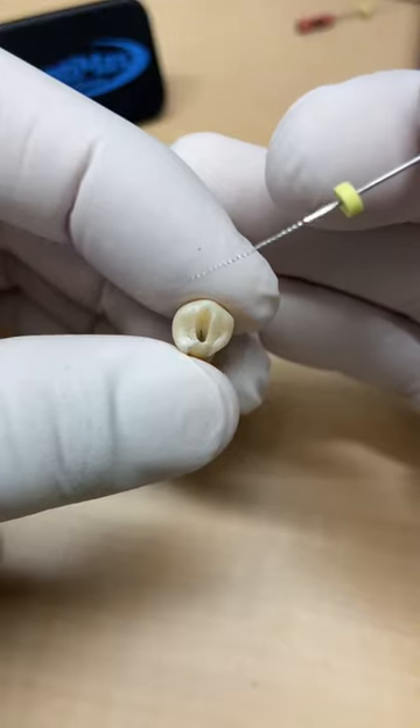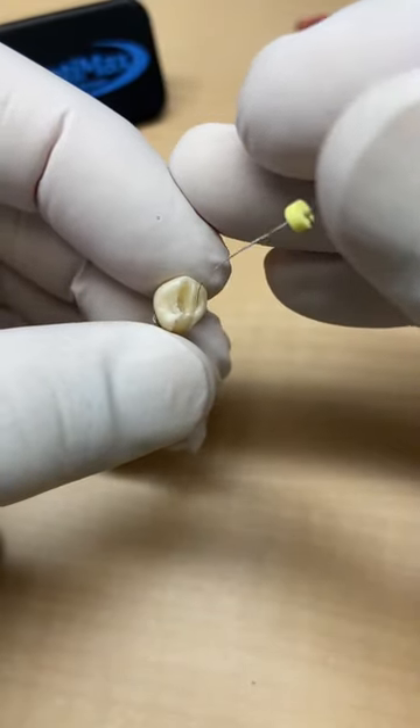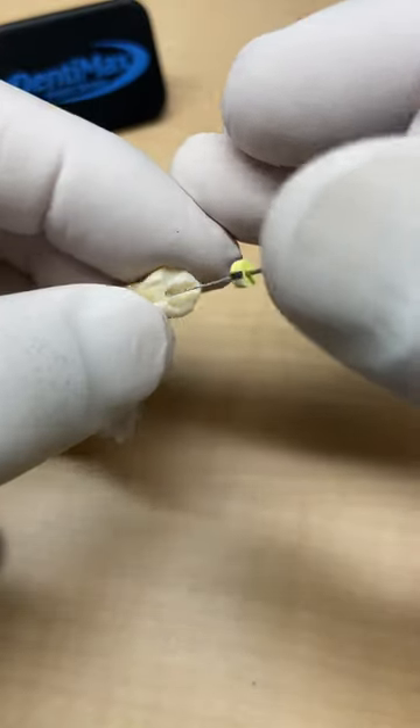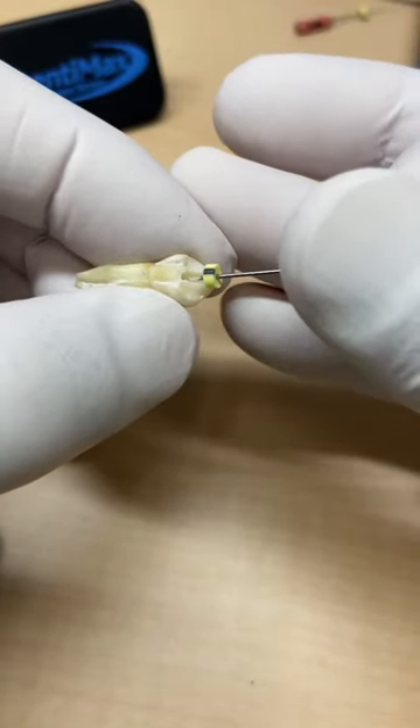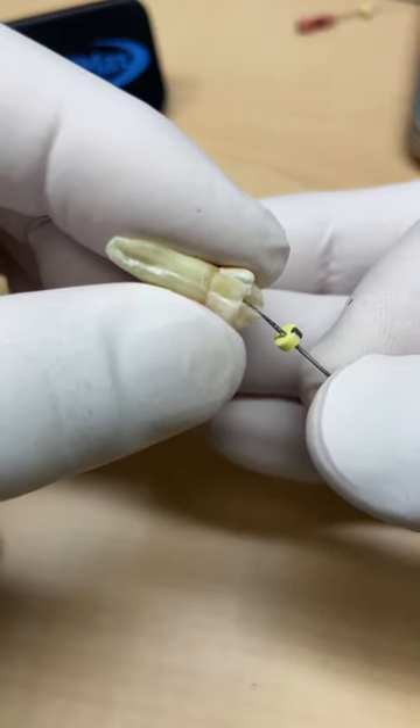What we'll need to do is bend our file a little bit to be able to access into that lingual canal. I'm looking through my phone trying to do this — there's the main canal and let's see if we can sneak out that other one.